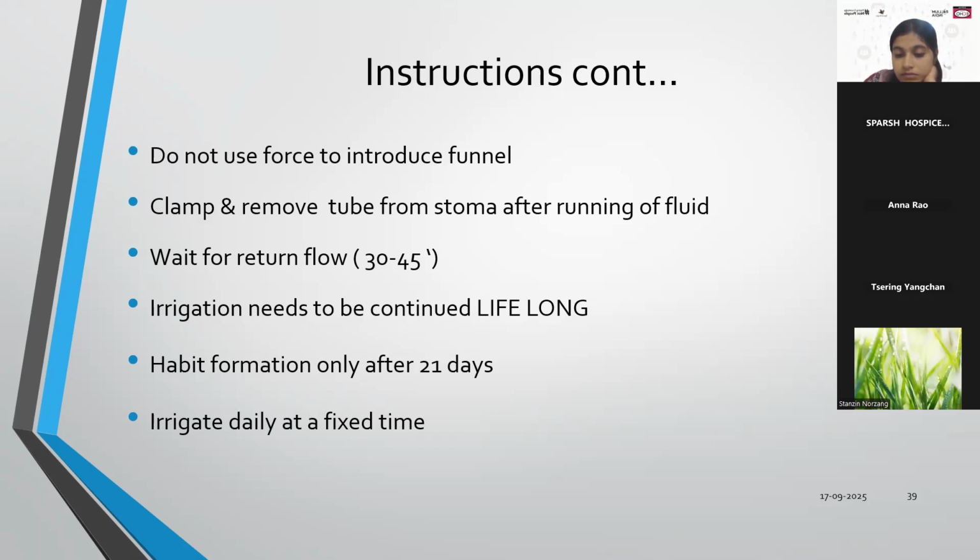Otherwise you are introducing air into the patient's bowel, and it will cause bulging, irritation, and gas. So when we are preparing the set, run the fluid so that all the air is removed from the tubing. Then lubricate it and insert the funnel or the cone into the stoma, and slowly with the help of the regulator allow the fluid to go into the colon.